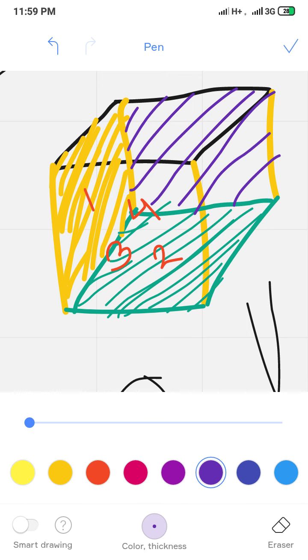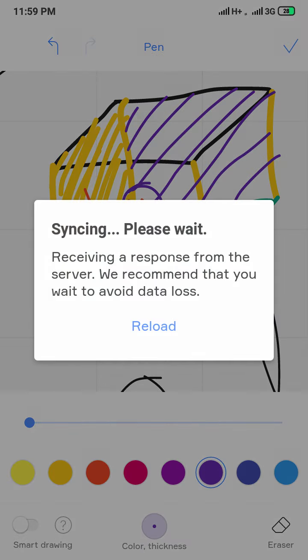So a canal orifice might be anywhere, but there is a higher chance among these 4 positions. Number 1 might have a canal opening, but number 2 will have a higher chance. Number 3 will have an even higher chance of having a canal orifice because it's the joining of 2 walls. Number 4 will have even more chances of having a canal orifice because it's the joining line of 1, 2 and 3.